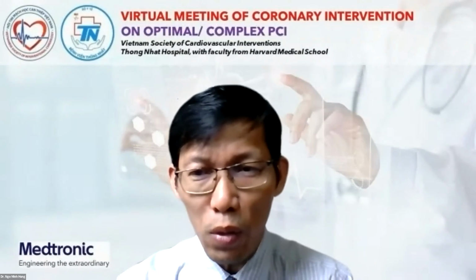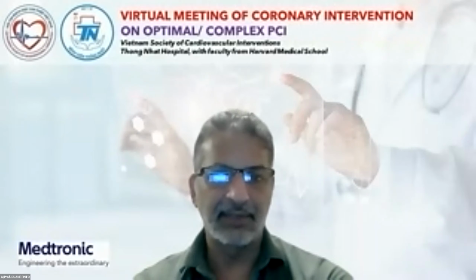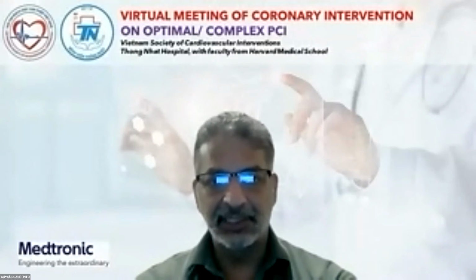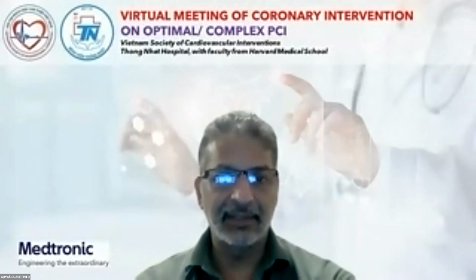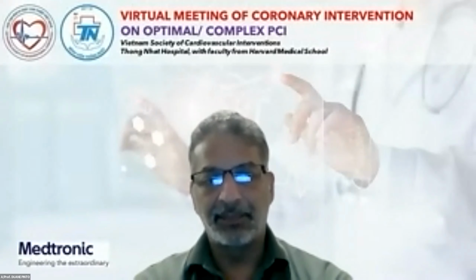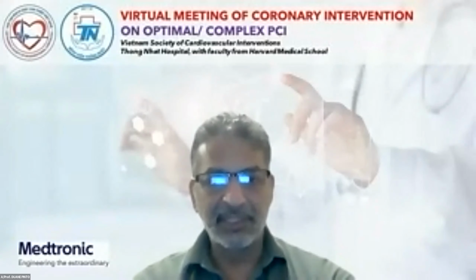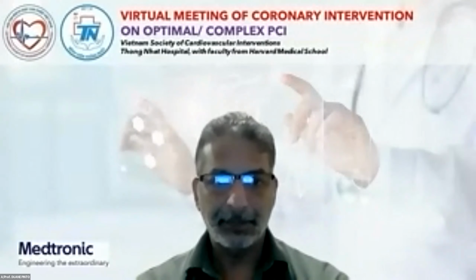Yeah, I'd say most often on imaging, I'm seeing concentric ISR. It's infrequent that I see it not involve almost the entirety of the stent circumferentially. I will see focal areas of underexpansion that may be eccentric. And in that case, I'll just dilate with the balloon, etc. But I just apply the same strategy as the algorithm I put forward for in-stent restenosis. I don't really consider the morphology of the restenosis beyond whether it is neointima or not. I usually apply the same. Yeah, thank you very much.